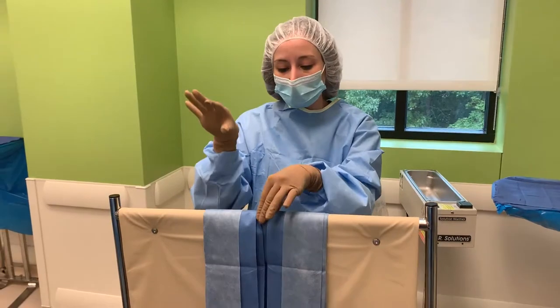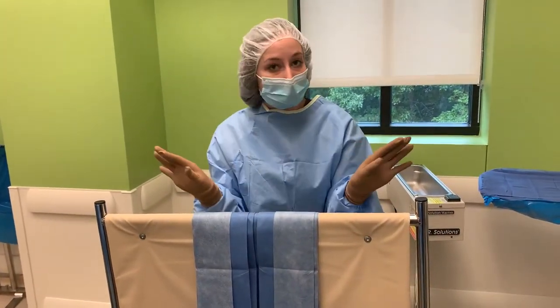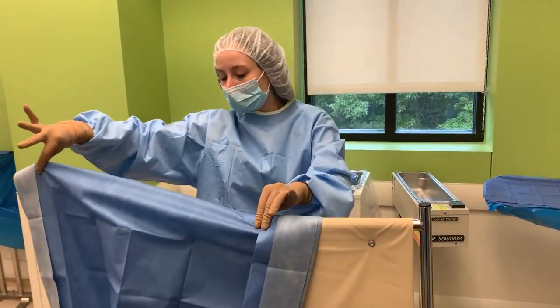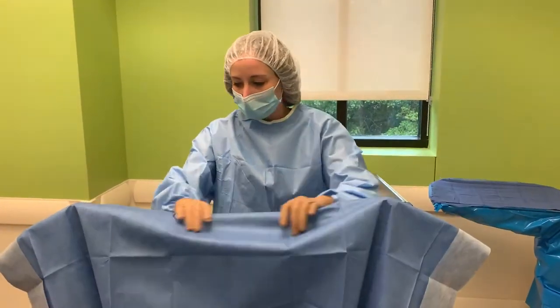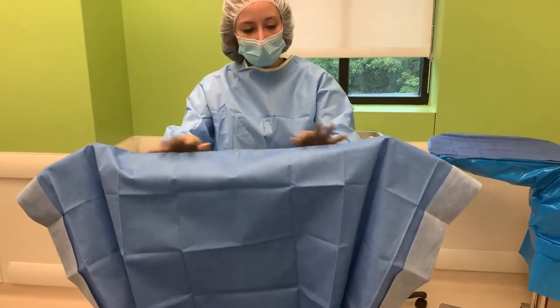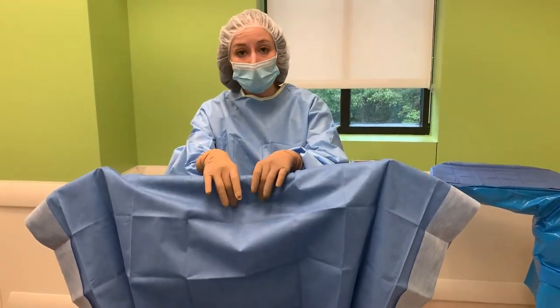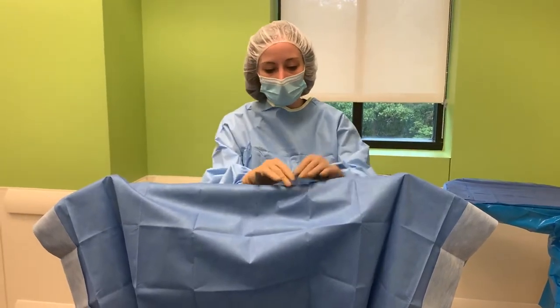Hold your hand in the middle and go from each side — it doesn't matter which side you do first. Pinch and just move it over to the side, same thing on the other side to the left. Keep your hands on top. Make sure you don't grab below that tabletop level — you always want to stay on top.